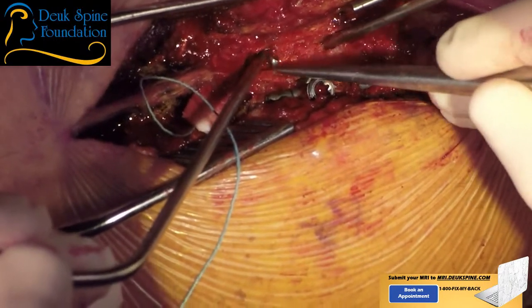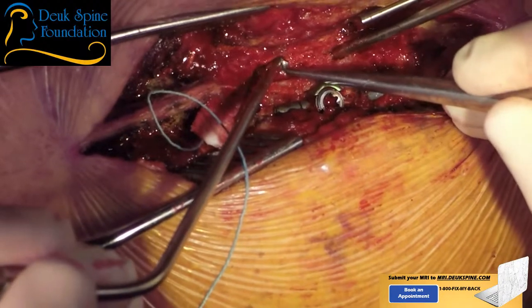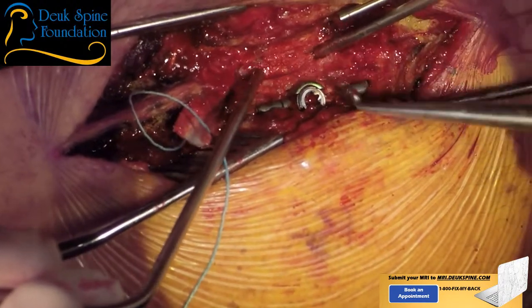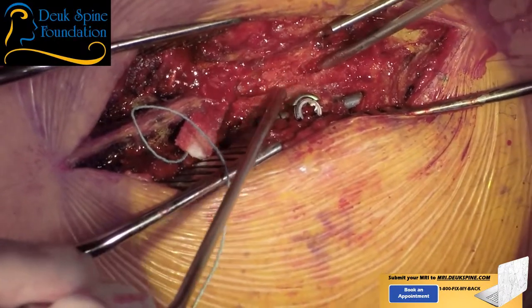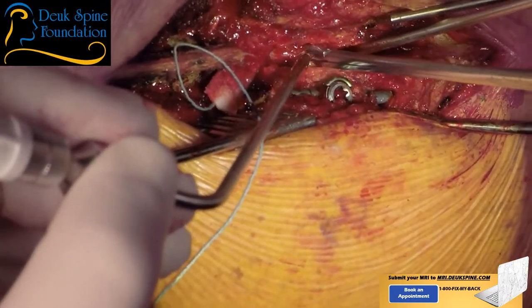Wow, that's so scarred down. Pituitary. You want the narrow one? Pituitary, please. Just give me a pituitary. I'll tell you what I want. I'll make whatever you give me work.